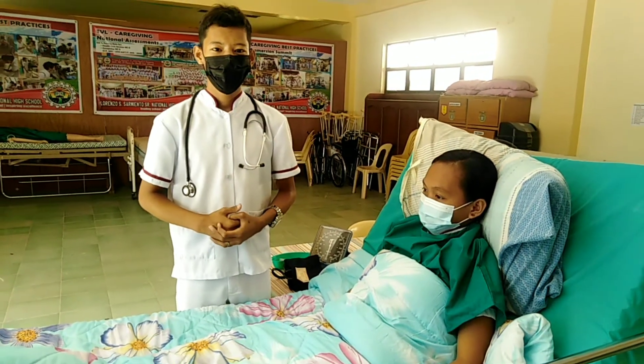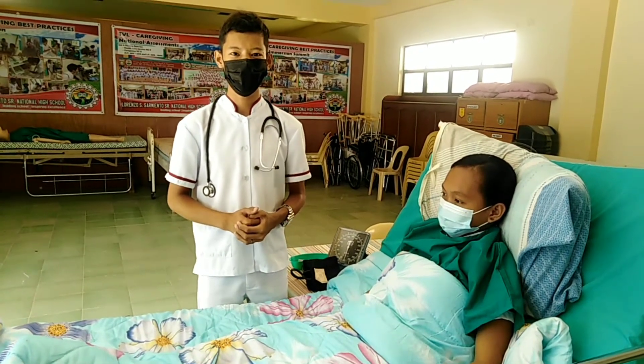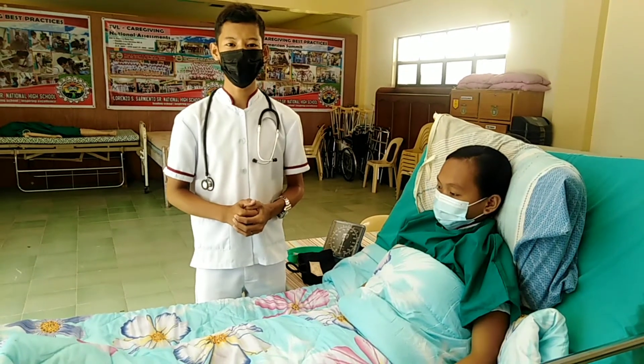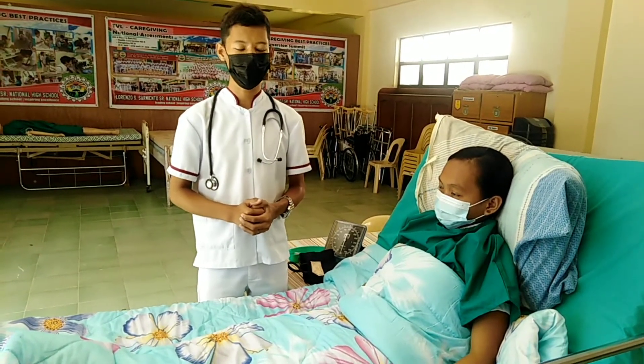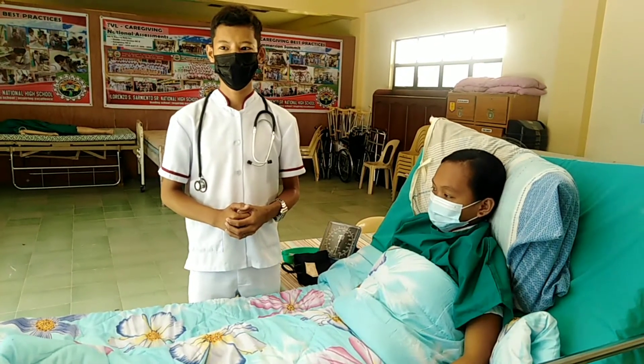Good morning sir. My name is Jolan Filima, a caregiver from Lorenzo Esometo Senior National High School, and I'm here to take the procedures in taking vital signs. Wash your hands, prepare all the required equipment, and check the client's identification. Explain the purpose and the procedures to the client.